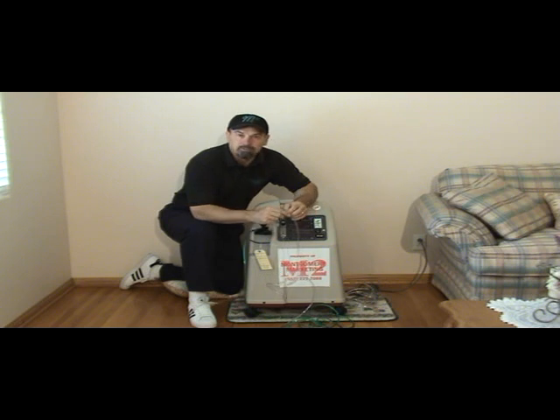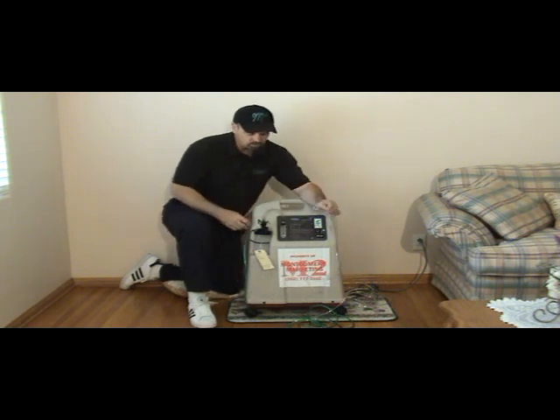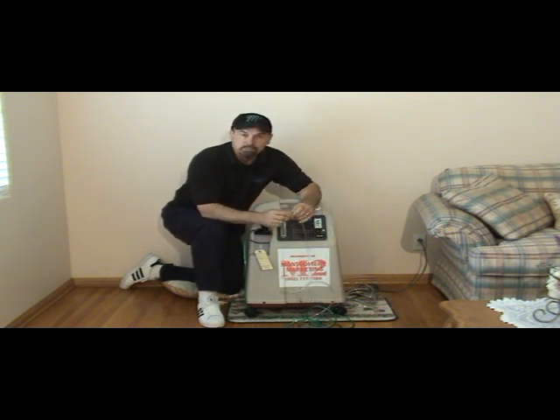However, if you do need to provide it with the 20 feet because you're trying to do other things as far as dignity or helping the patient to stay active as long as possible, then it is possible that we can provide that tubing, but not further than 50 feet. Okay? So right now we've gone over the connections, which include delivering to the patient with a nasal cannula or a mask. We've gone over hooking up the humidifier bottle with the piece of tubing that connects to the unit. We've gone over hooking up extended tubing.